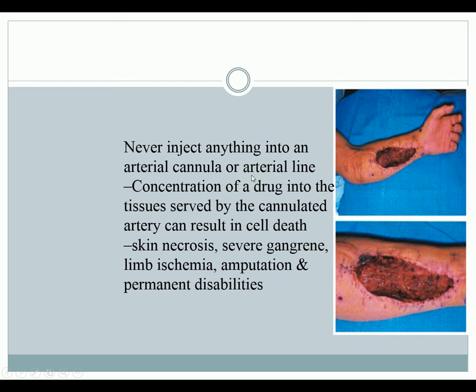Never ever inject anything into an arterial cannula or an arterial line. Concentrations of drugs into tissues can result in cell death and can result in something similar to this. So you would never ever want to be responsible for this. It can result in necrosis, gangrene, limb ischemia, loss, amputation, permanent disabilities.